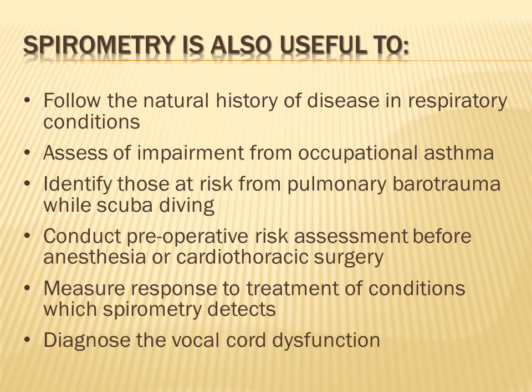Not everybody is familiar with using such kind of apparatus, so to identify who is at risk, spirometry is essential in such a condition. Another usefulness of spirometry is to conduct preoperative risk assessment before anesthesia or cardiothoracic surgery.